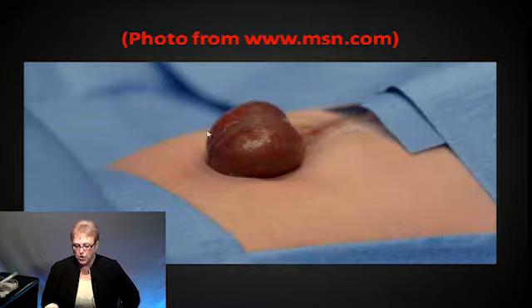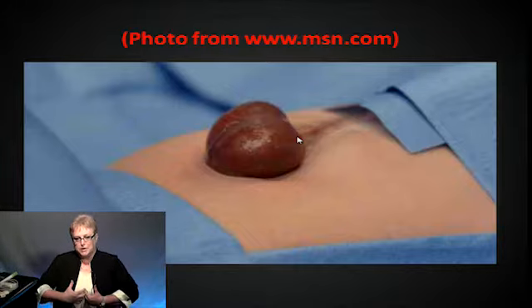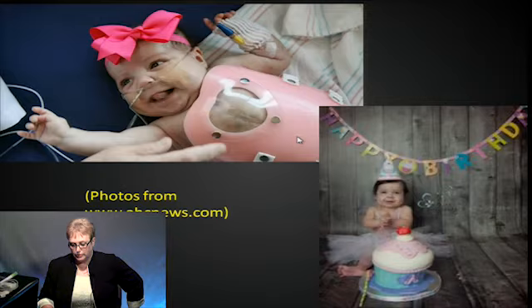This is a picture of the heart. About a third of the ventricles were protruding. And what happens is now the chest, because it hasn't been expanded, the entire heart hasn't been inside, you have to slowly try to expand that chest so that we can try to get the heart back in.